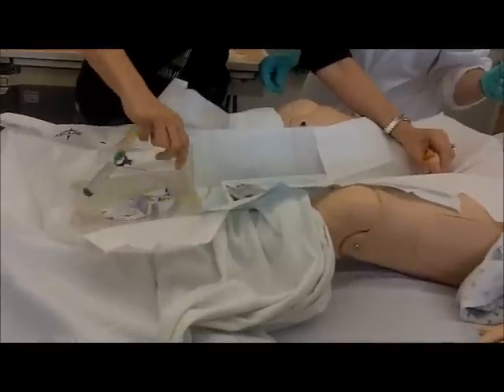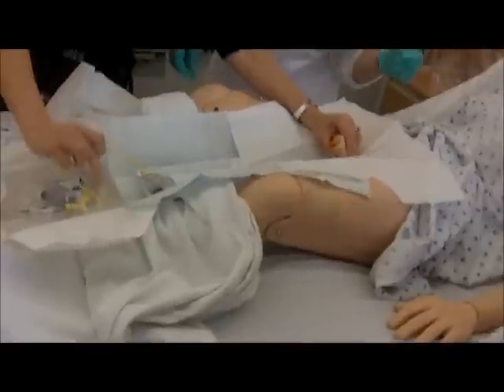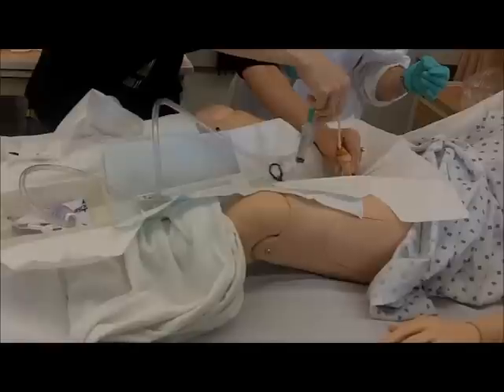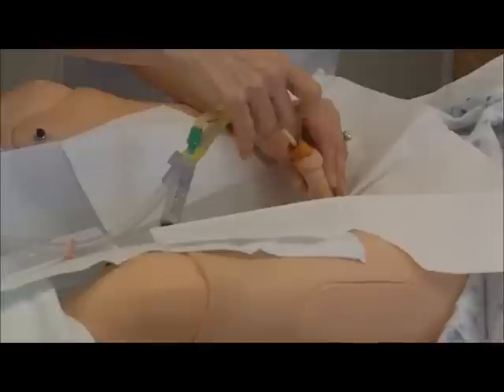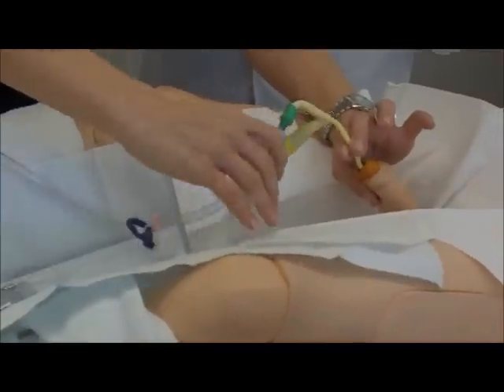You almost like hold it like this. You don't want to really wrap it too much, because then when you put it in, you don't want your catheter going all over the place. Insert. Normally we insert until we see urine flow back. And once the urine is coming back, then we inflate our balloon.